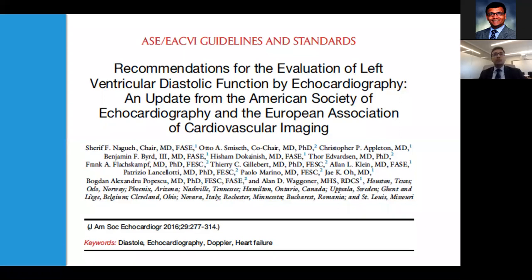The document stresses quality and consistency of information, particularly between two or more indices of diastolic dysfunction that have to be relied upon during the interpretation. And it also clearly states that systolic and diastolic dysfunction are closely connected phenotypes. To a great extent, a simplification of the proposed schematics happened.